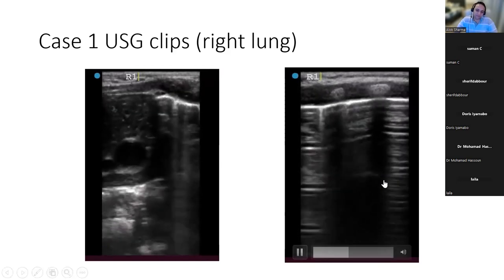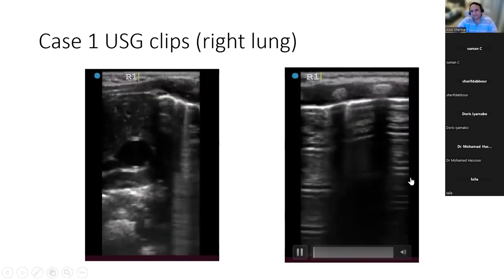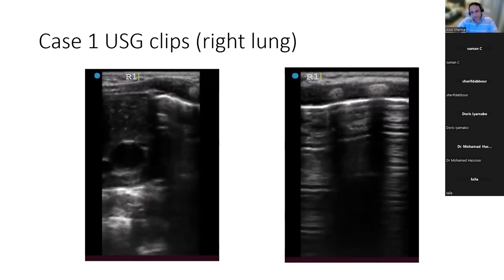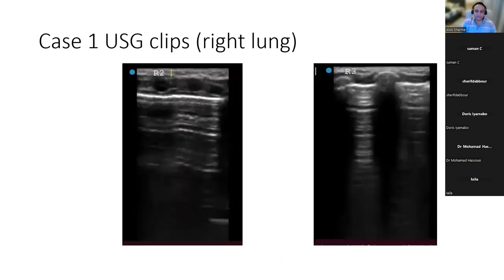At this point, I probably applied the jelly again. Because it was R1, I could get it with the same settings. And it might be the jelly that was the problem with the previous images, but this is a beautiful image. I would say that this is perfect. My compliments. We'll carry on. Thank you.